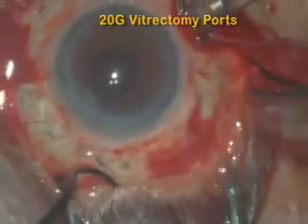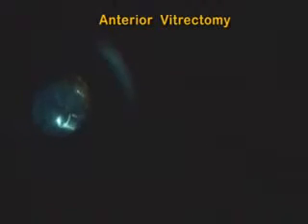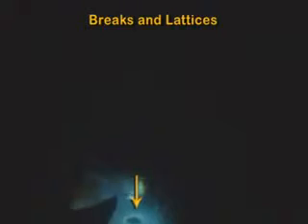After 360 degrees encirclage and creation of standard 20-gauge vitrectomy ports, anterior vitrectomy and core vitrectomy are performed. The fundus shows an attached superior and superonasal retina, an inferior bullous retinal detachment involving the macula with breaks and lattices inferiorly. A complete vitrectomy is done and vitreous along the lattice is trimmed. After marking the breaks, fluid-air exchange is started.